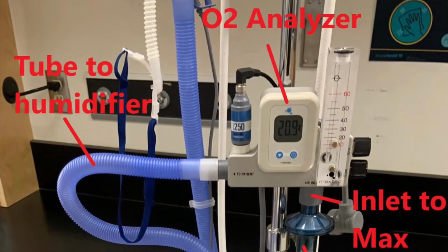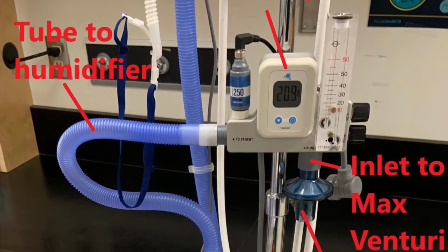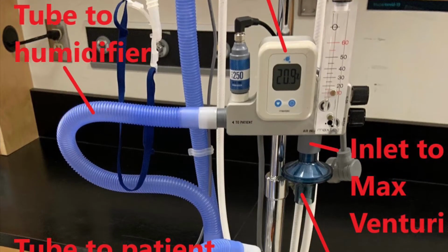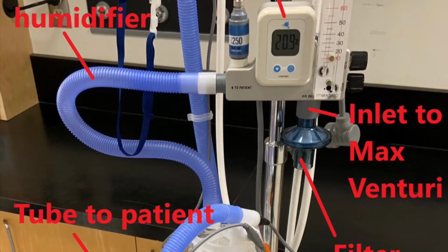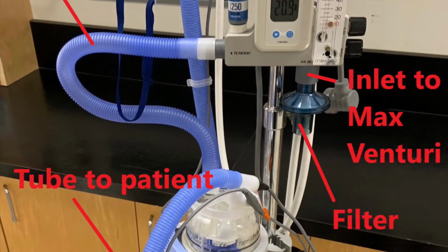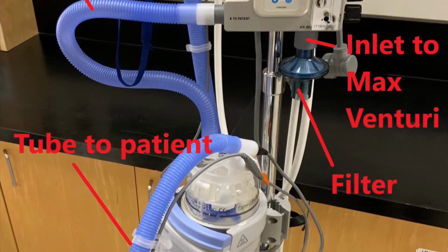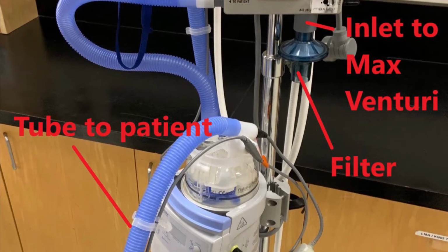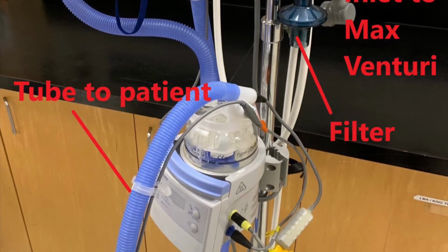The blender in this system is called the Max Venturi blender. So air gets drawn in through a filter at the bottom of the blender. The filter is there to prevent any dust or other debris from getting drawn into the system. Plus, it also acts as a noise muffler. It keeps the sound down. There's an oxygen analyzer and a flow meter that's part of the system as well. You set the flow that will then flow out from this device and flow to the humidifier.